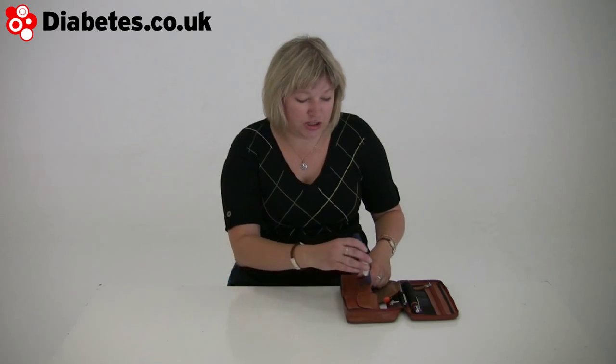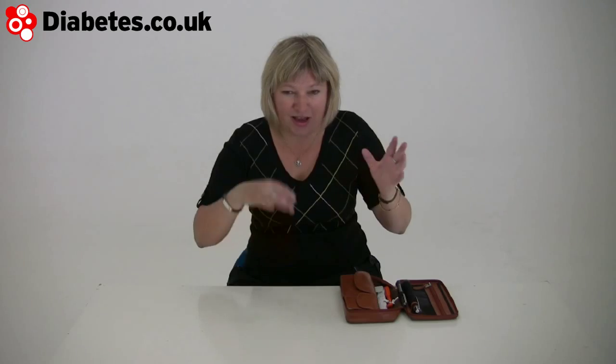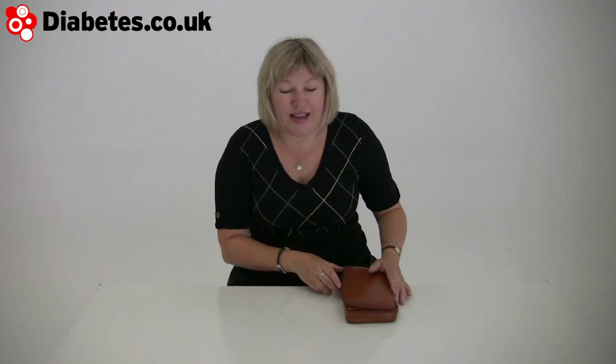It's a bit frightening when you first see it because there's just so much information. If you're anything like me, it looks like a war zone — results left, right and centre, up, down, all over the place. But it is actually normal. That's pretty normal. I think people don't know to expect that, but it is pretty much the way it is.